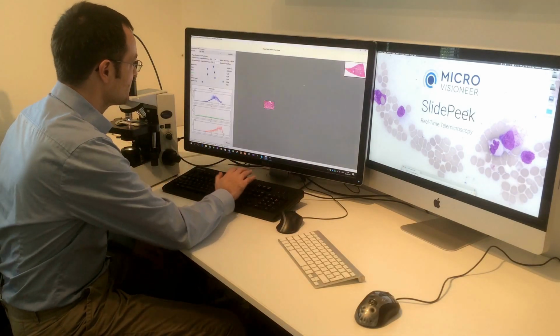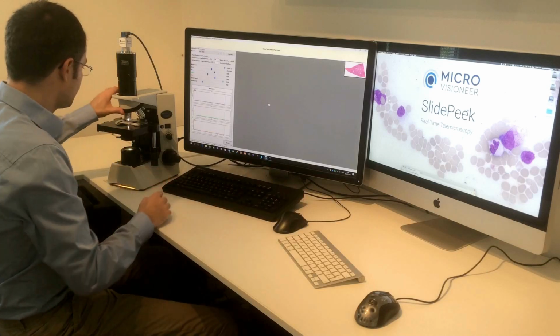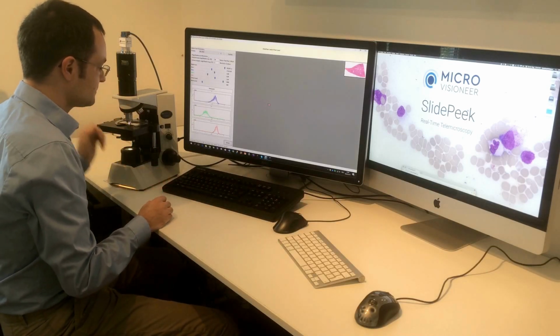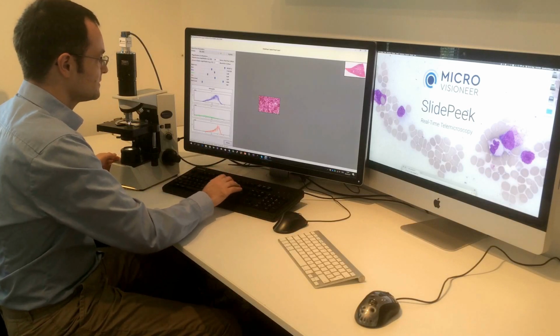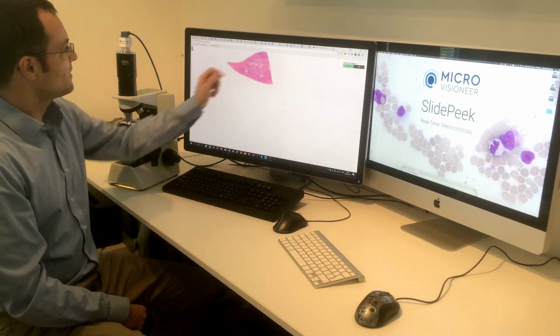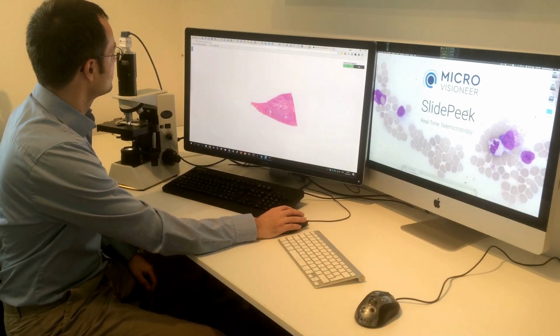And for that step I prepare the 40x scan. Zoom in. Yes. So now it opens the website of the scan, and then it shows the URL here.